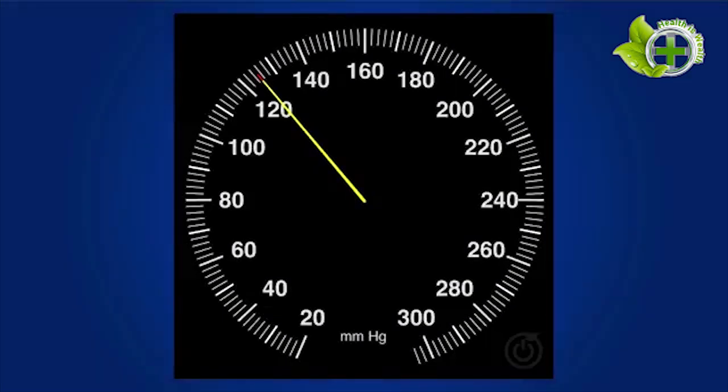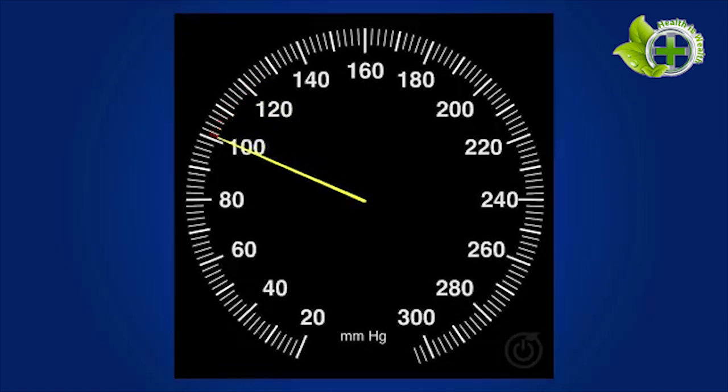When you arrive at the point of the procedure where you slowly deflate the cuff to hear the sounds, you will notice the needle move in a counterclockwise direction. It is at this point that you need to listen very closely for the thumping sounds.